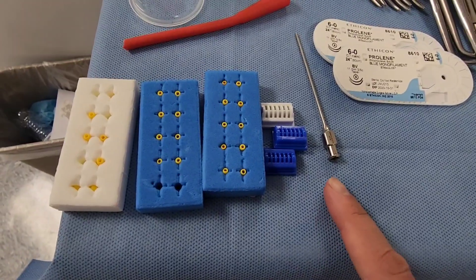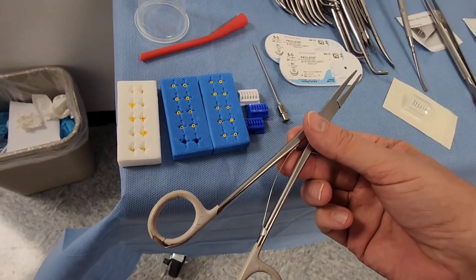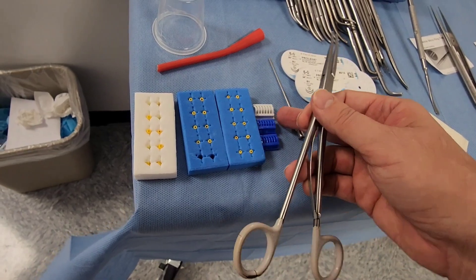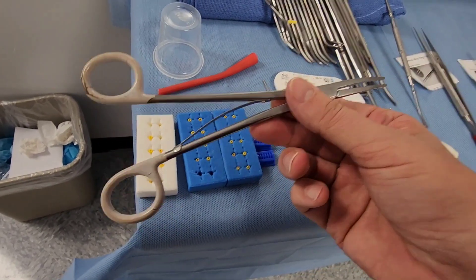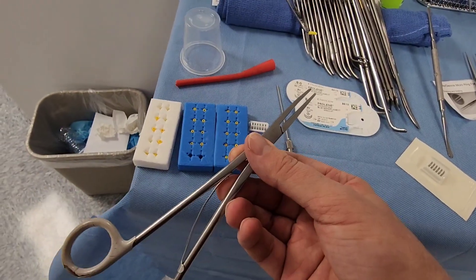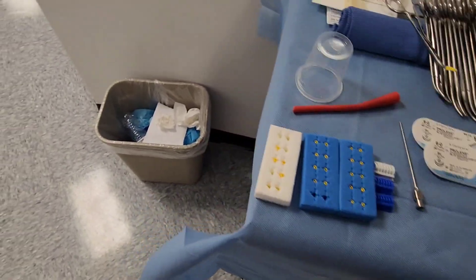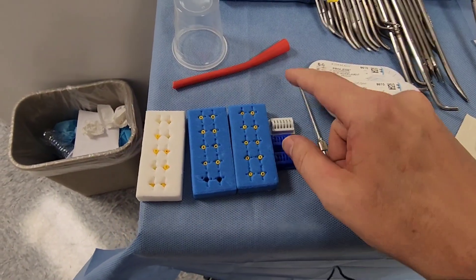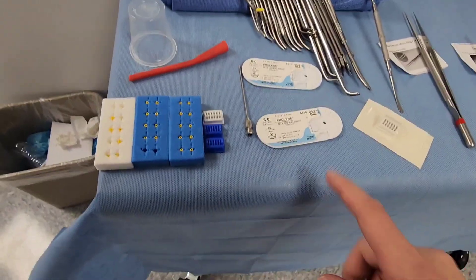Next up are the blocks or boats — these are for the clip appliers in vascular cases. They're a repurposed clip applier and come in different sizes: blue and white, medium or small, corresponding to the color on the bottom of the applier. They're disposable hemostatic devices to stop bleeding in small vessels. These are accountable items — suture boots, blocks or boats — so they need to be counted.